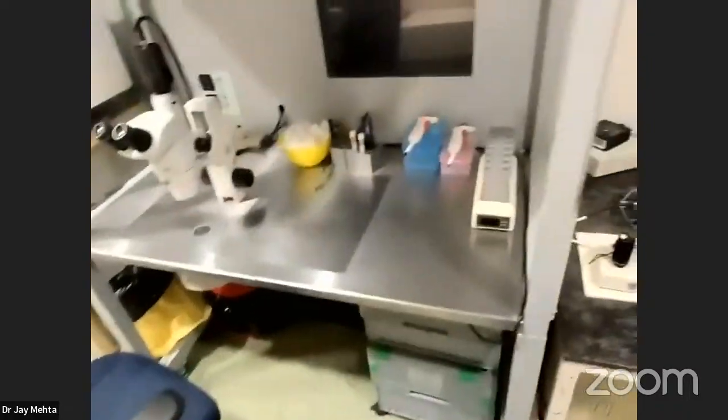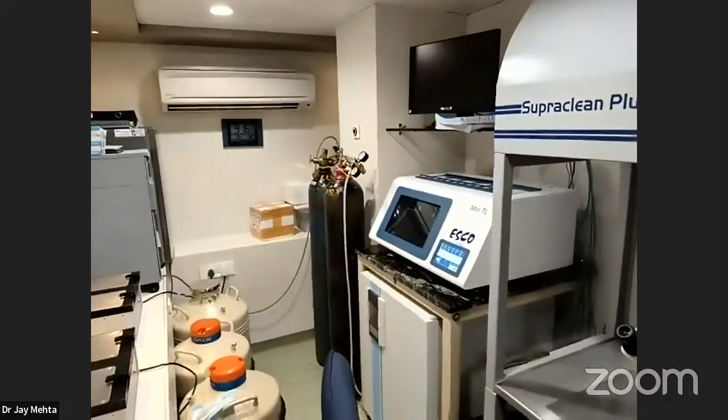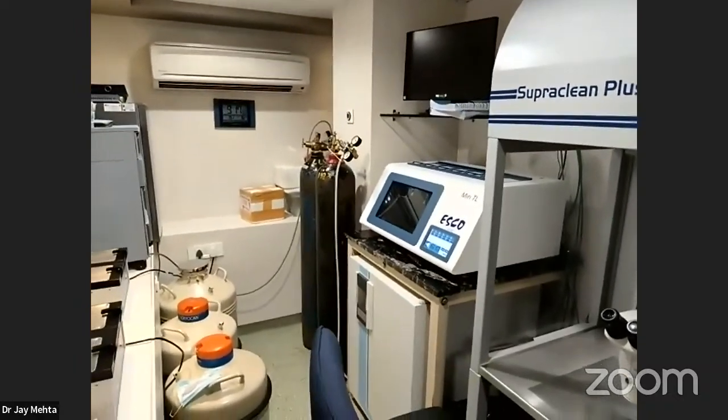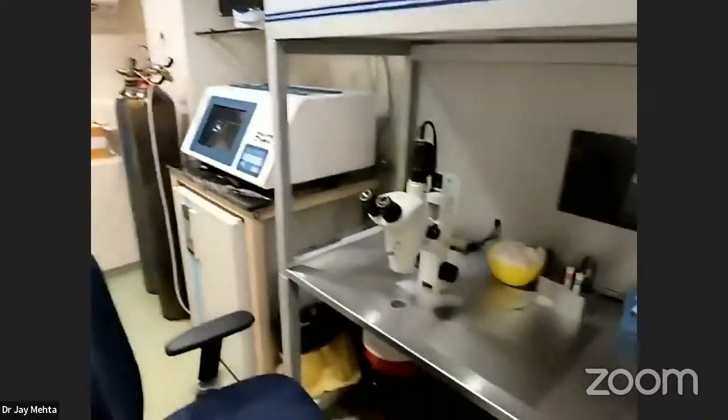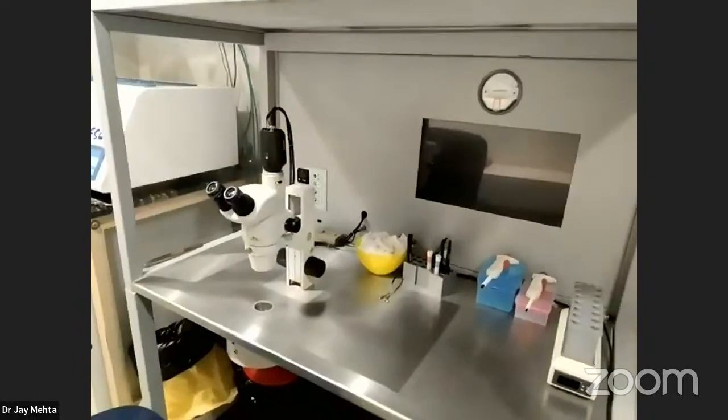Okay, the third thing is, can you see the cylinders there which are supplying the gas? I have double cylinders. I have cylinders which are this pre-mixed dry gas, what you can see, and behind that I have a connection for central cylinders. That means my Hera cell is supplied by central CO2. But my ESCO, that is my time lapse, is supplied by medical dry gas, and these dry gas cylinders have to be optimized, because if they are not correct, it will severely affect your embryo formation rates. So that is something which you have to keep in mind.